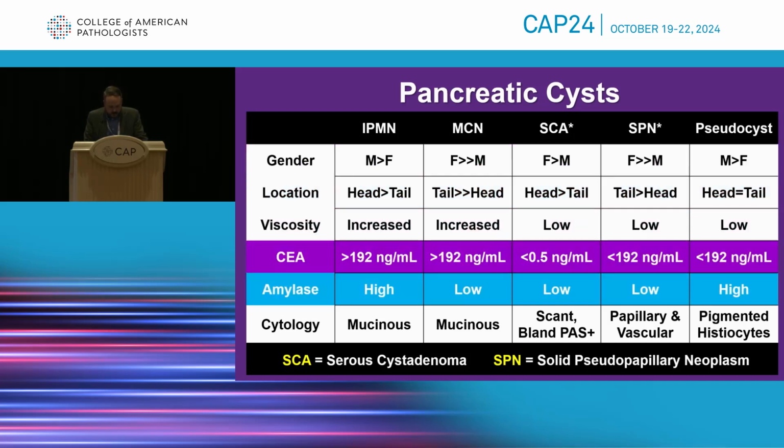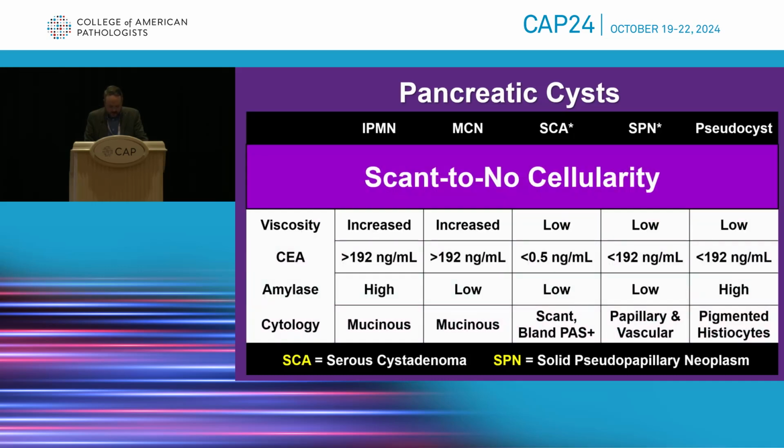You'll have this table in the handout, so I won't go through these in too much great detail, but certainly these are things that can provide information.